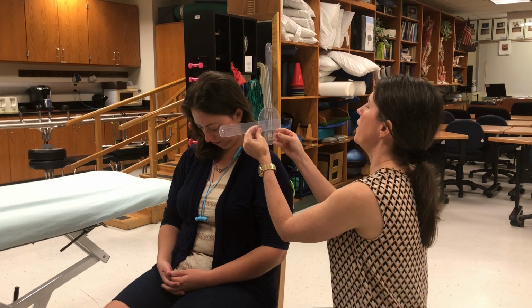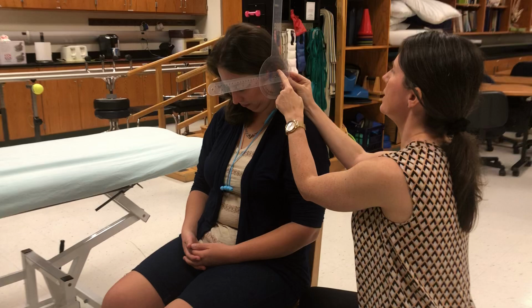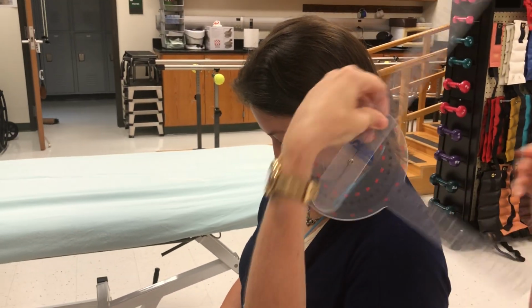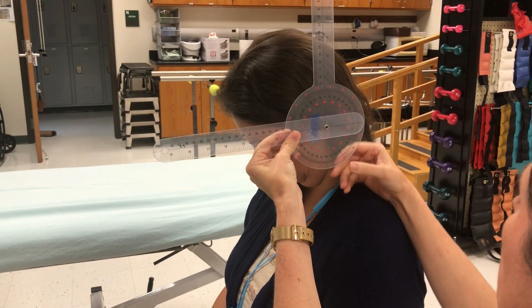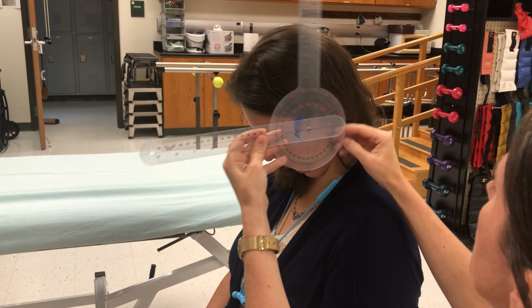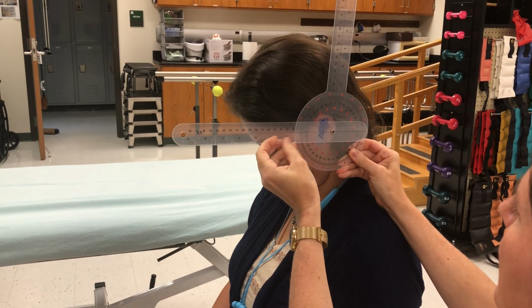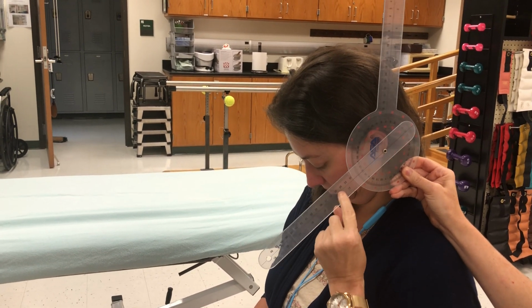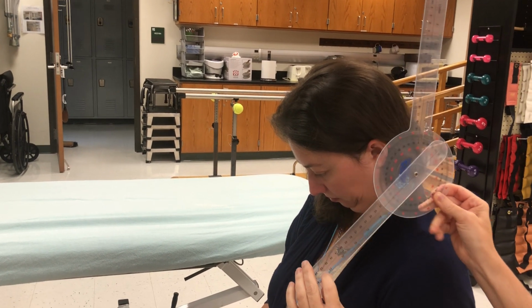And then the fulcrum goes directly over the external auditory meatus, and the stationary arm is perpendicular to the floor. Perpendicular to the floor is up or down, but in this case, down would hit the patient's body, so we're gonna hold it up. Notice that my hand back here is resting on her shoulder, so my goniometer is nice and stable. Also notice that I'm not pressing this up against her head. And so my starting point is out here, because that's where her nose started. And then I bring this down and I line up this center black line along the moving arm to the base of her nares. All right, you can take a little break.